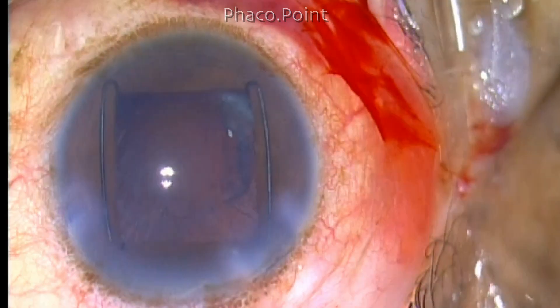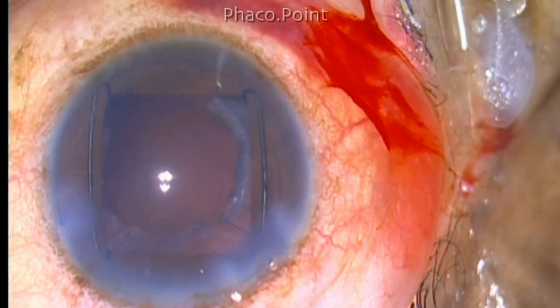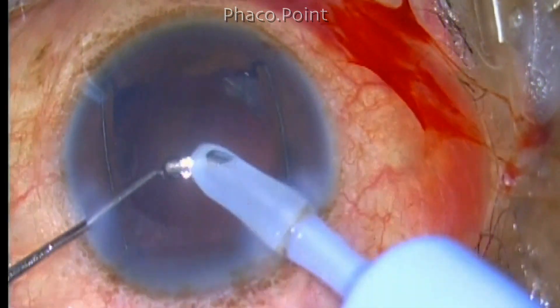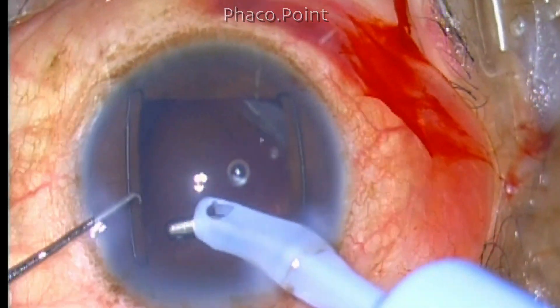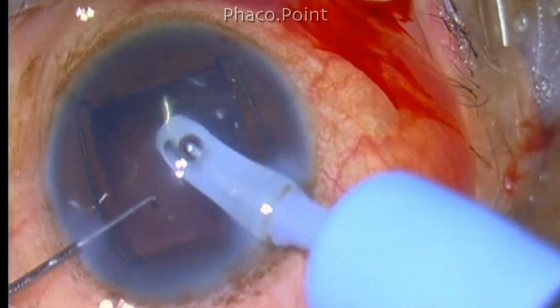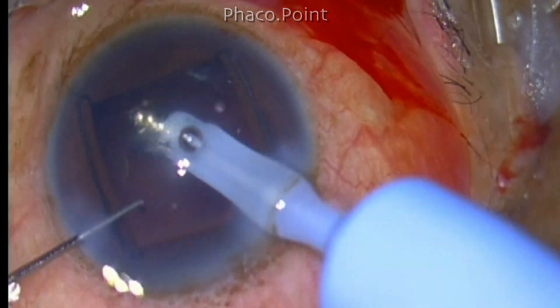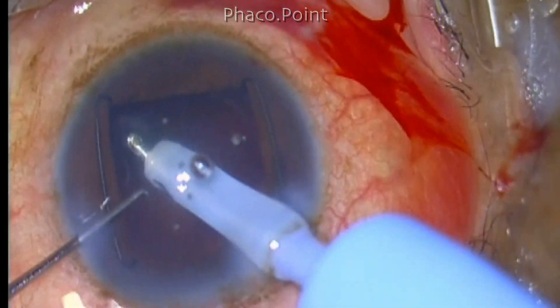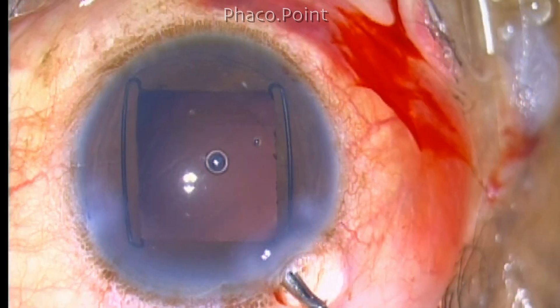Be careful — the posterior capsule is thin; it may trampoline and hit against the phaco probe, creating a rent. You must be careful when removing the last fragment. Cortical aspiration is then performed, which also goes without a hitch. If you have very good cortical cleavage hydrodissection, most of the time you are left with hardly any cortex and no thick epinucleus shell. In this case, the cortex is removed with considerable ease.